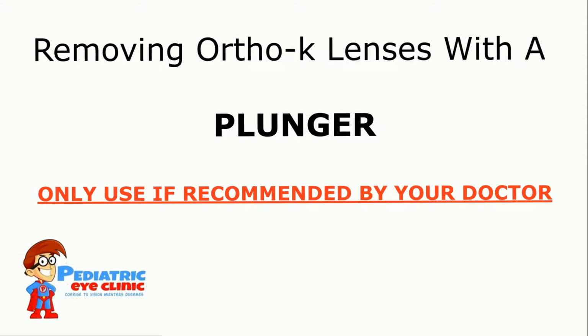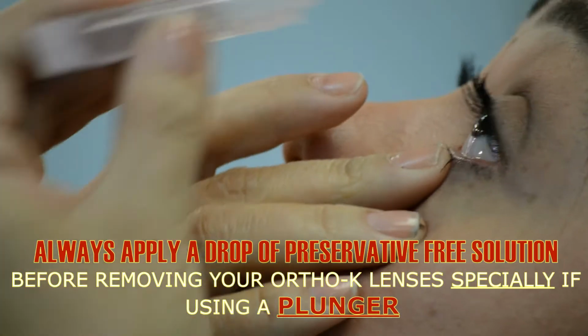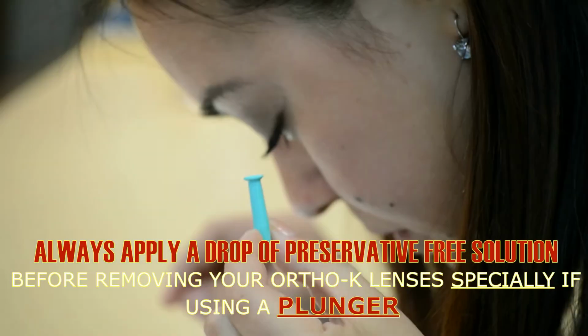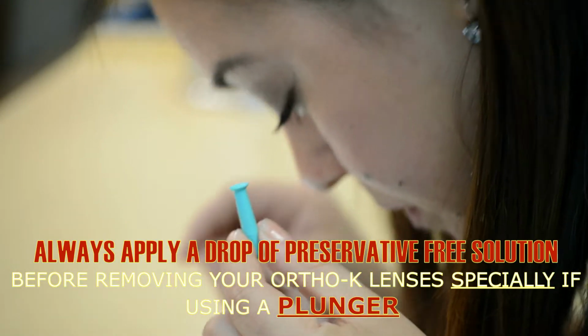Now let me show you how to remove your Ortho-K lenses with a plunger. Remember, a plunger must only be used if recommended by your doctor. Remember to always apply a drop of the preservative-free solution recommended by your doctor before removing your lenses, especially when using a plunger.